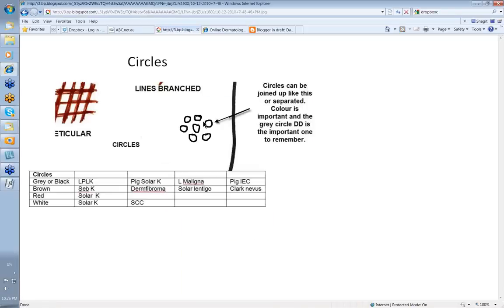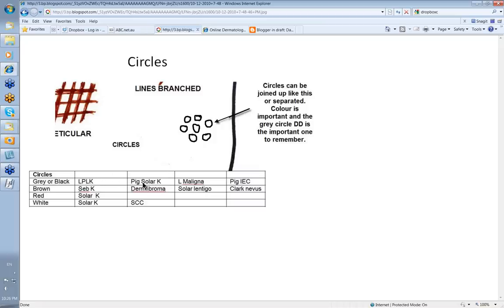Generally most circles are separated. If the circles are joined up and together then we tend to call that lines reticular. There are various colors of circles, but the one you'll come across most often and the one most important for differential diagnosis is the grey or black circle. You tend to see these in lichen planus-like keratosis, pigmented solar keratosis, pigmented intraepidermal carcinoma, and lentigo maligna. We'll also look at some brown circles, red circles, and white circles a little bit later.